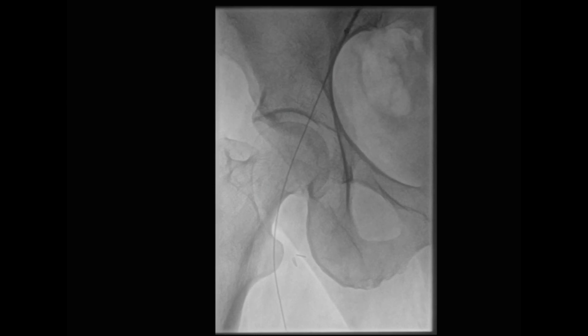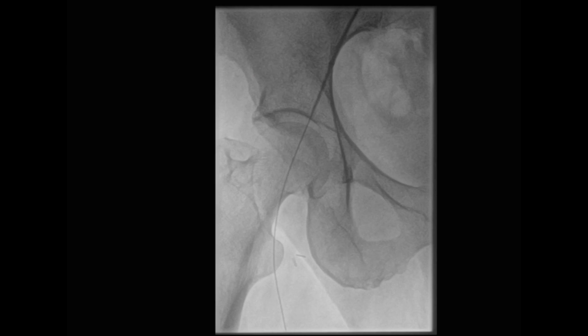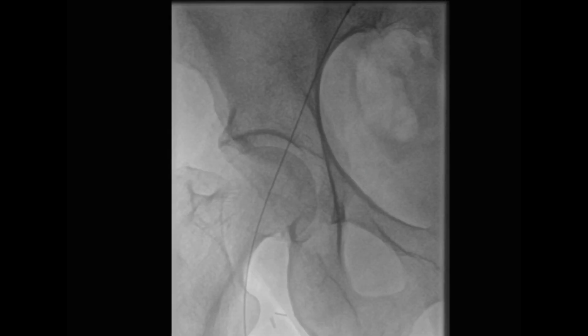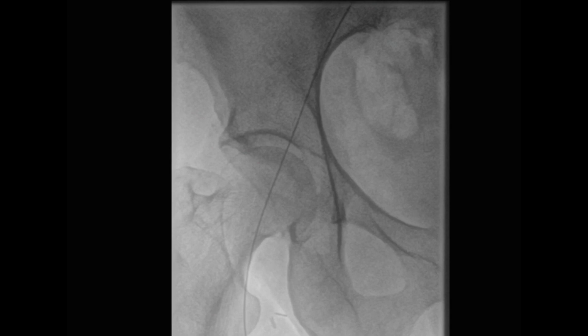At this point in time, the patient was heparinized and a 6 French sheath was introduced into the right common iliac artery to provide support.